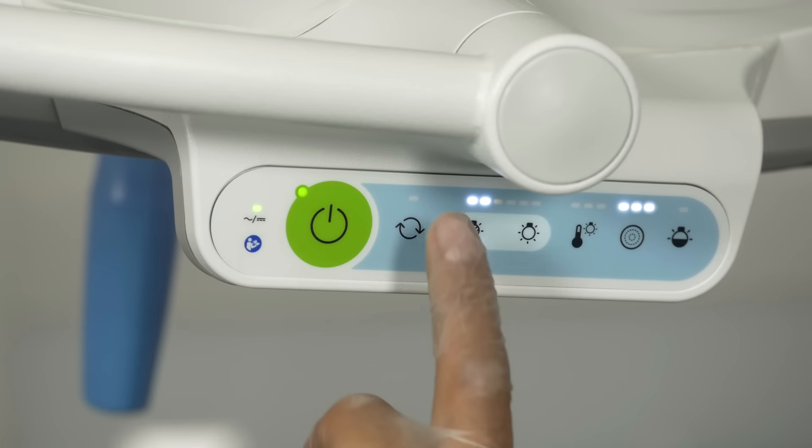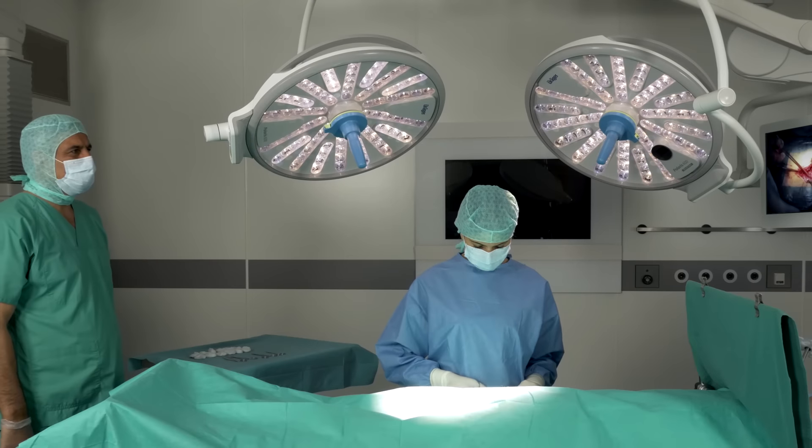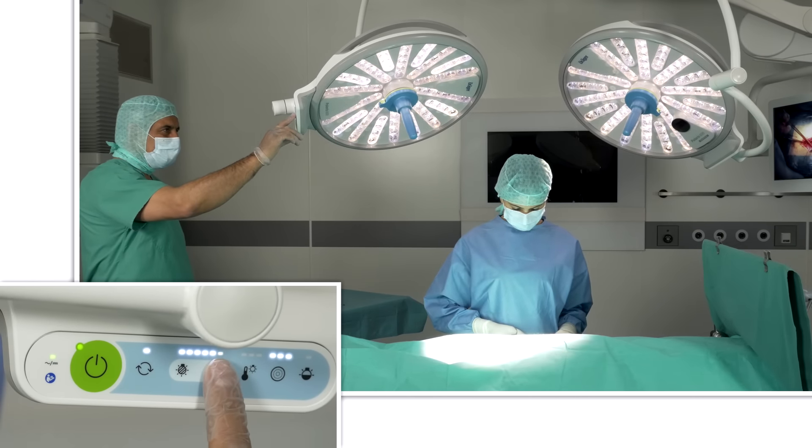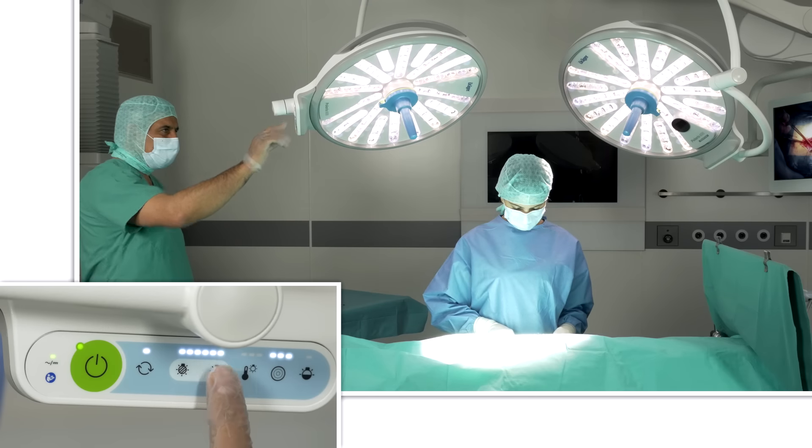In synchronization mode the settings are carried from a user interface to all connected lights. This saves time, ensures precision and helps to optimize the process.